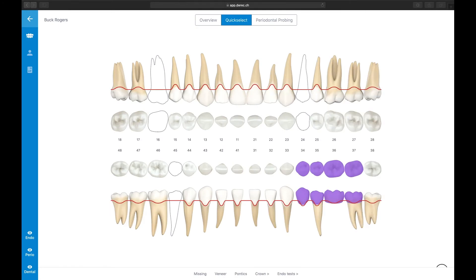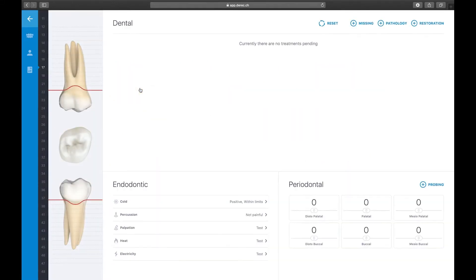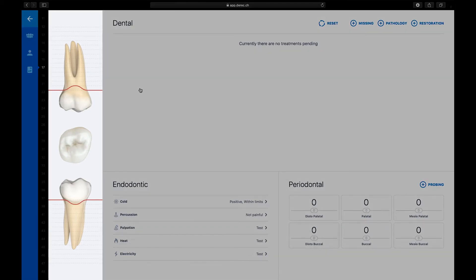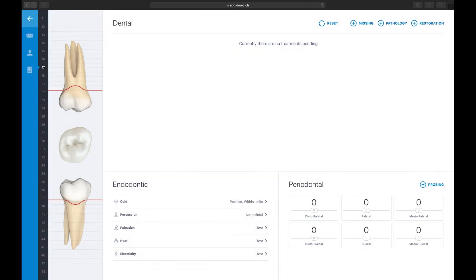Let's take a look at how to enter tooth-specific findings. In a clinical situation, most dentists do a full mouth checkup with a systematic approach, going from one tooth to another. In Derek, we created a special single tooth view for entering specific tooth data. Select the overview bar item in the top portion of the screen, then select the tooth in the chart you want to enter data on. Derek jumps straight to the single tooth view, which consists of four sections: a graphical illustration of the tooth situation, the treatment list section, the endodontic status, and the periodontal status of the tooth.